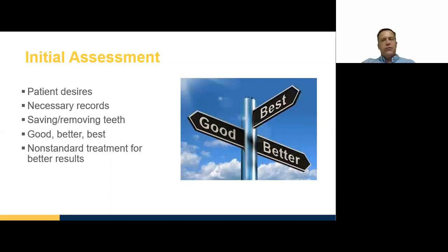If you have a facial scanner, this is a good time to take a 3D scan of the patient's face, so you can, especially when you're doing any interdisciplinary planning, share that with your colleagues. If you have a CBCT scan, it'll help you if you decide you will be doing some implant therapy.